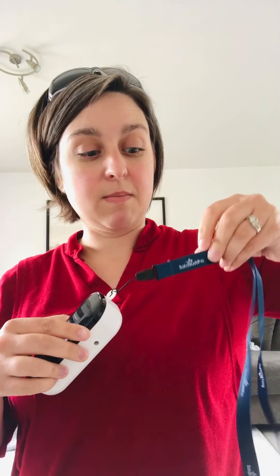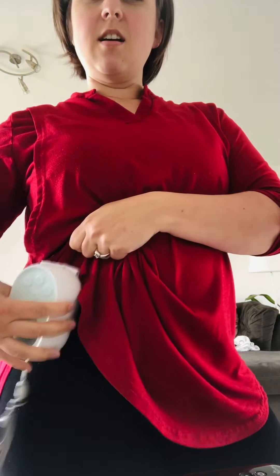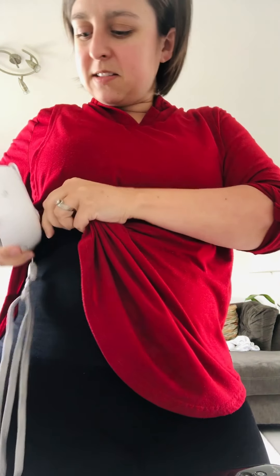As far as functionality, I really love that the Baby Buddha has a lanyard because it makes it really easy to wear hands-free with a hands-free pumping bra or cups. This Pumpables one also has a lanyard, which is really cool, and it also has a clip so you can clip it onto your pants.